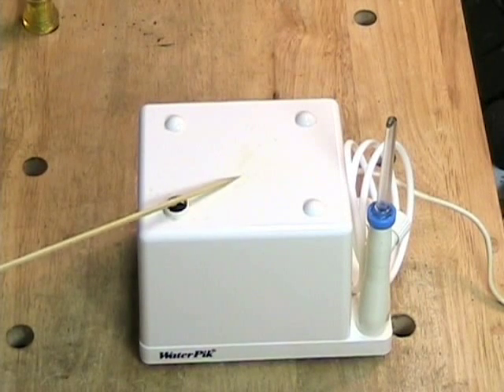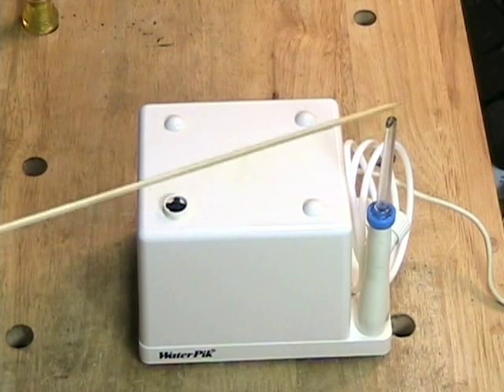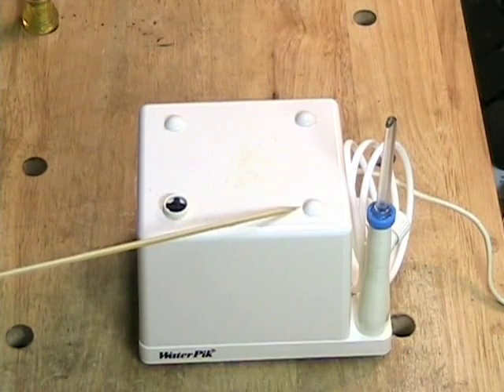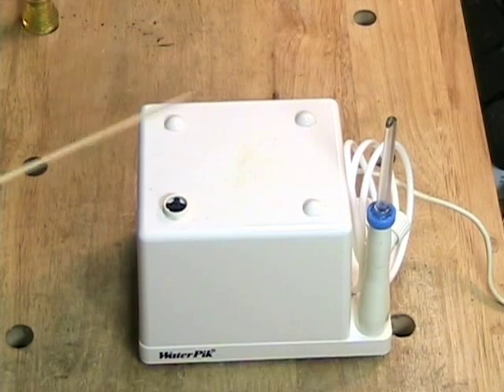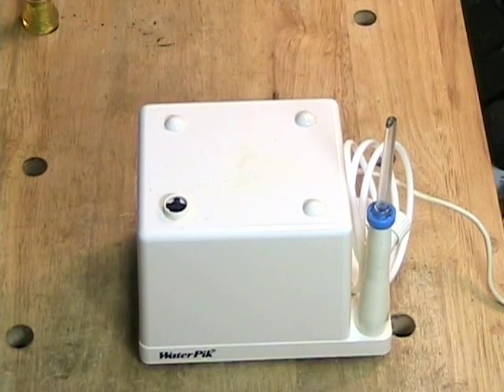It's basically a hydro flosser which, as you probably know, squirts water through this wand into your teeth to try and get the stuff that gets in between your teeth out. It also massages your gums and so on. You can find out a lot more about water pick by visiting the water pick company and discovering everything they want to tell you about it.